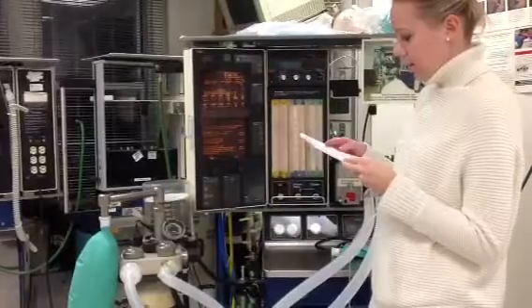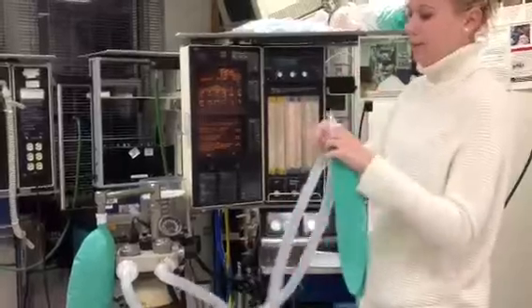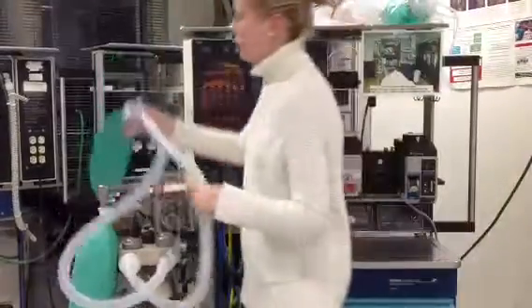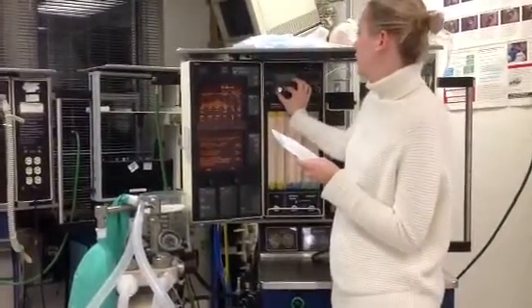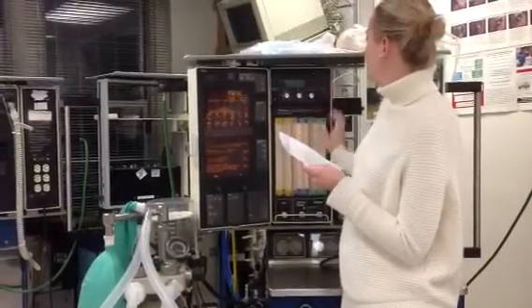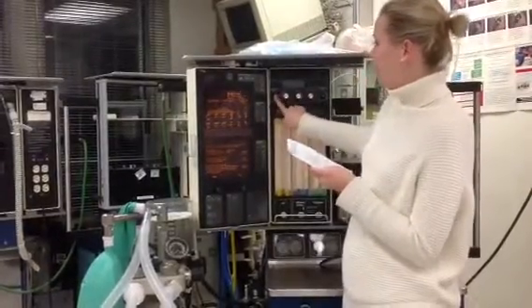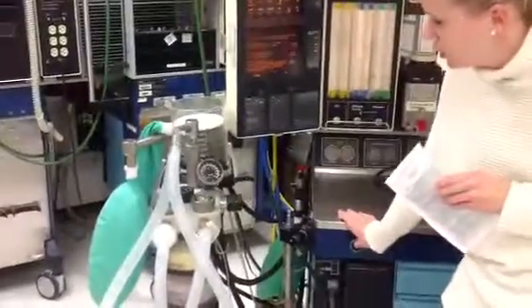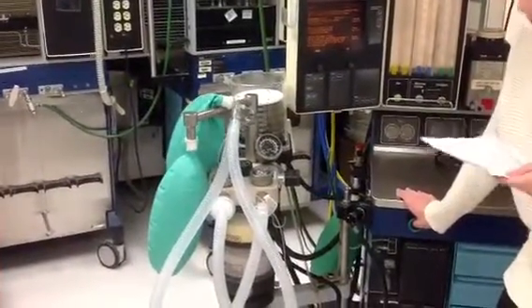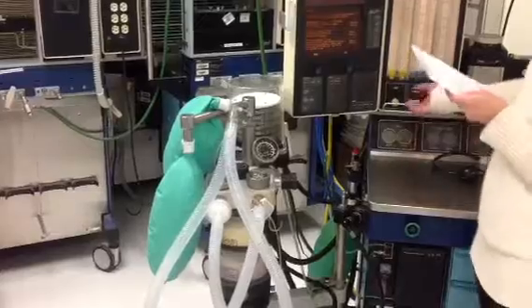Then we're going to do a manual and automatic ventilation system check. Place second breathing bag here. Make an artificial lung. Set your appropriate parameters, tidal volume, rate, inspiratory flow. Switch the ventilator on. Fill the bellows and the breathing bag with the O2 flush. Set your O2 flow to minimum.